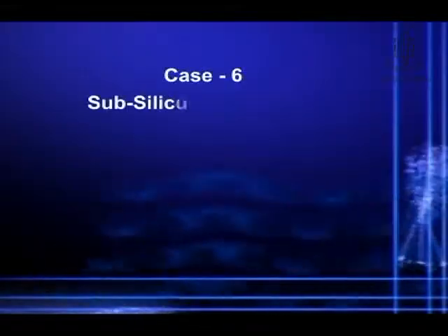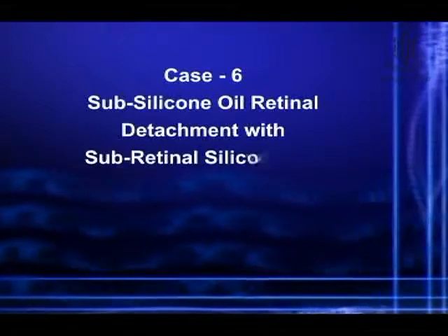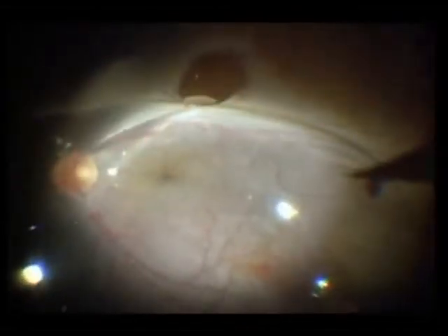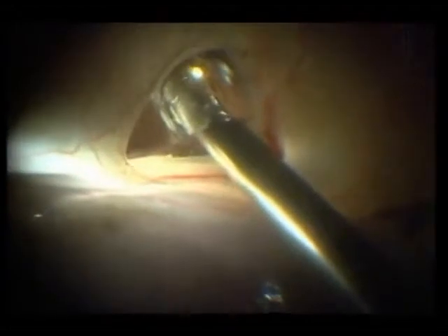Case 6 has a detachment with subretinal silicone oil. In this situation, PFCL is injected to displace the subretinal silicone oil towards an open break inferiorly, and then the oil is gradually aspirated. After that, a relaxing retinectomy is done to relieve the traction. Endolaser barrage is carried out.